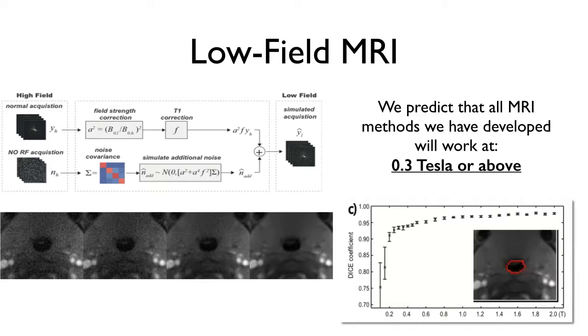So this actually has pretty significant implications, because lower field strengths will obviously be more comfortable because there are fewer safety issues and fewer physical constraints on the device. There's also less interaction with devices, so there's a greater potential at low fields for imaging people that have appliances or maybe even these stimulators installed. And it could open up some interesting doors for MRI testing in patients with this condition.